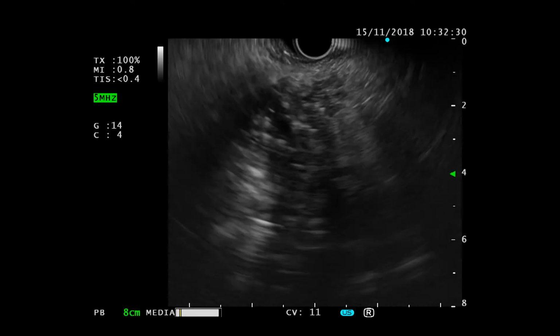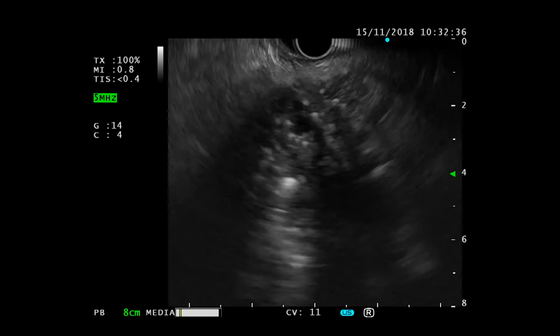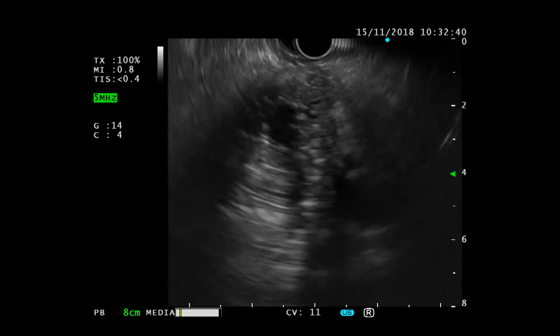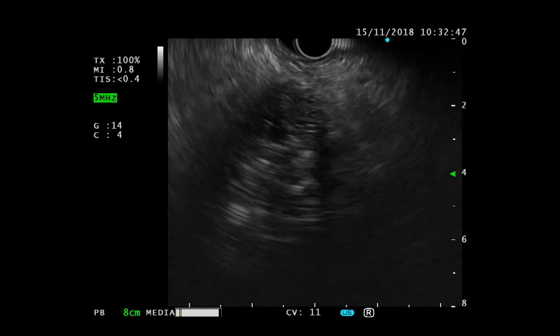Is there any specific sign that you try to identify to make sure there is no cancer in this heavily phlogistic reaction at the level of the pancreas? Well, till now I didn't see any focal lesion. But you look specifically for something that is typical for cancer?